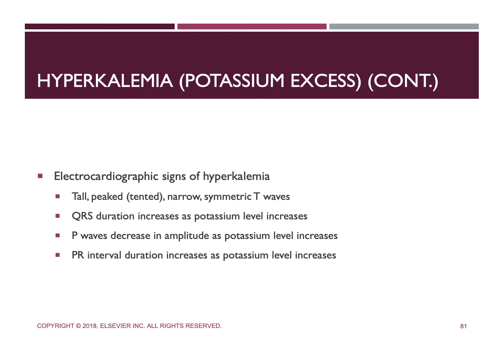When the potassium level nears 10, we're going to see intraventricular conduction delays and dysrhythmias, such as ventricular tachycardia, ventricular fibrillation, and asystole may even develop.